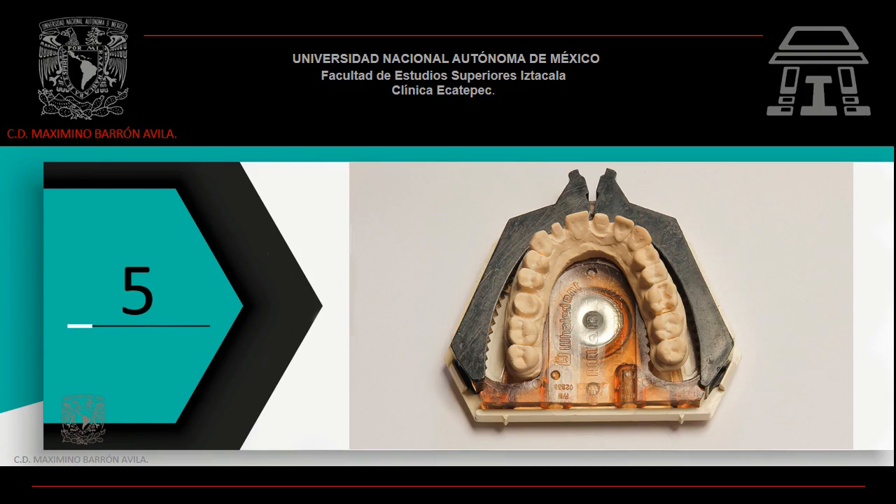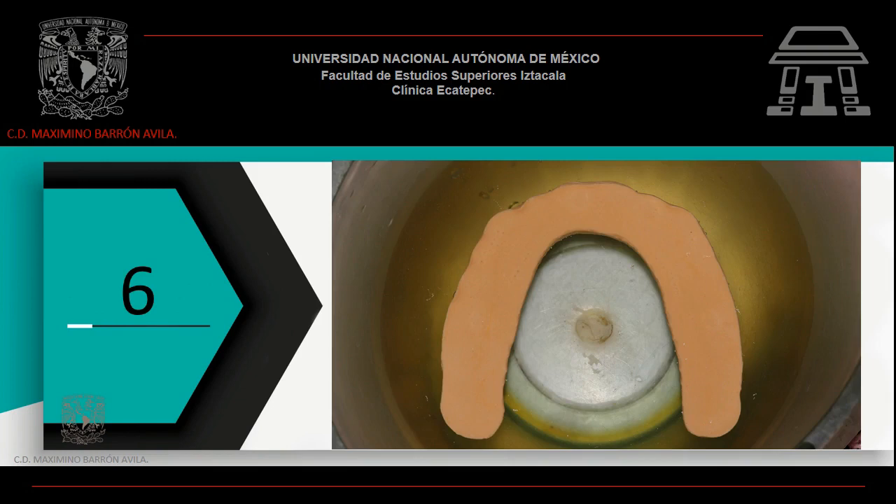Mide tu impresión en el sistema ACUTRAC. Debe de encajar con facilidad y, si no encaja, retira los excesos de yeso de tu impresión. Coloca el modelo de trabajo en una taza de hule con agua aproximadamente 5 minutos, con la finalidad de que el yeso se hidrate.